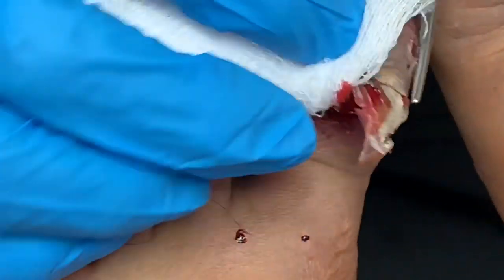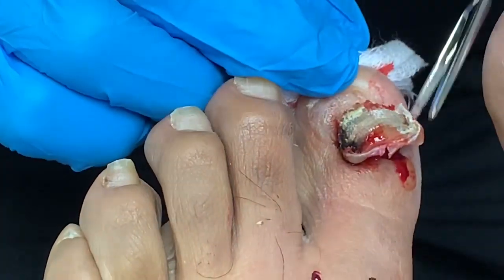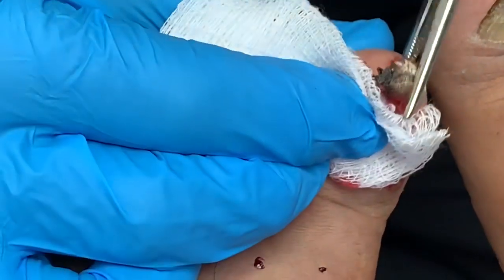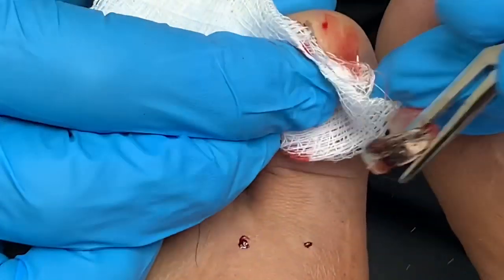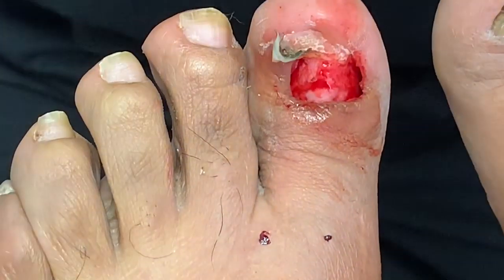This is just connective tissue — that's one piece right there. I'm just sort of teasing it with my finger; I don't want to hurt the underlying tissue. So we have two large pieces here.